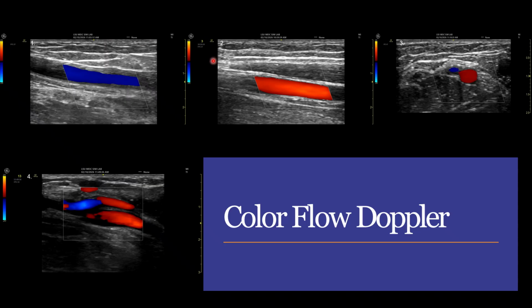So both of these first two images are longitudinal images. It's where you have an in-plane view of that vascular structure. And this little box here is called your color box. When you're setting this up, you want to make it as small as you possibly can for the structure of interest. Here it's opposed to the vein. It's got this thing called angle correction on it, but we don't need to get into that too much. Just notice the difference between the two different colors.